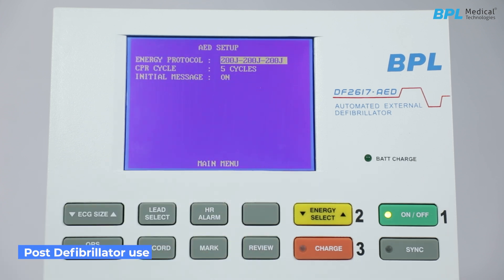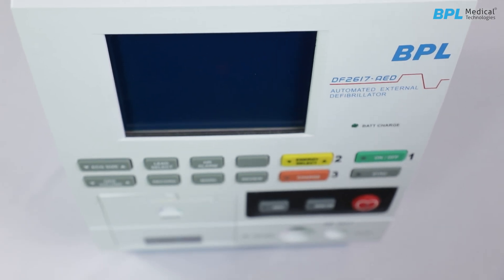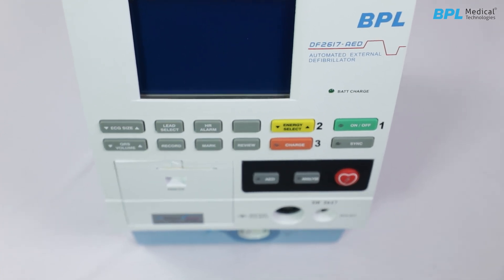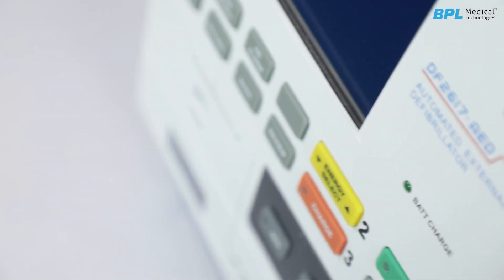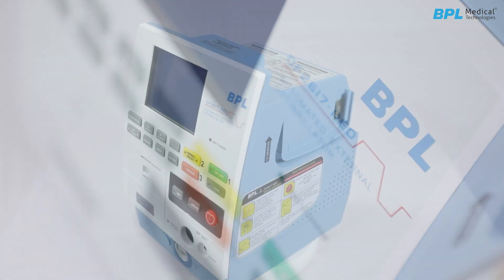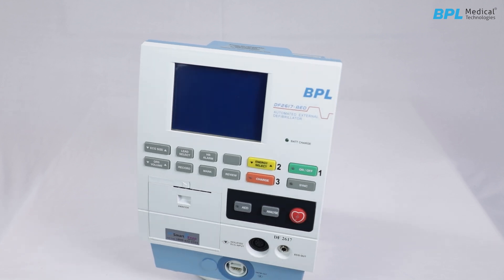Post-defibrillator use: Turn off the unit using the ON/OFF key. Store the defibrillator. Connect the AC mains power and ensure the battery charging LED is on. Always follow recommendations and safety protocols for accurate and reliable defibrillation. This concludes the process of unpacking and operating the DF-2617.